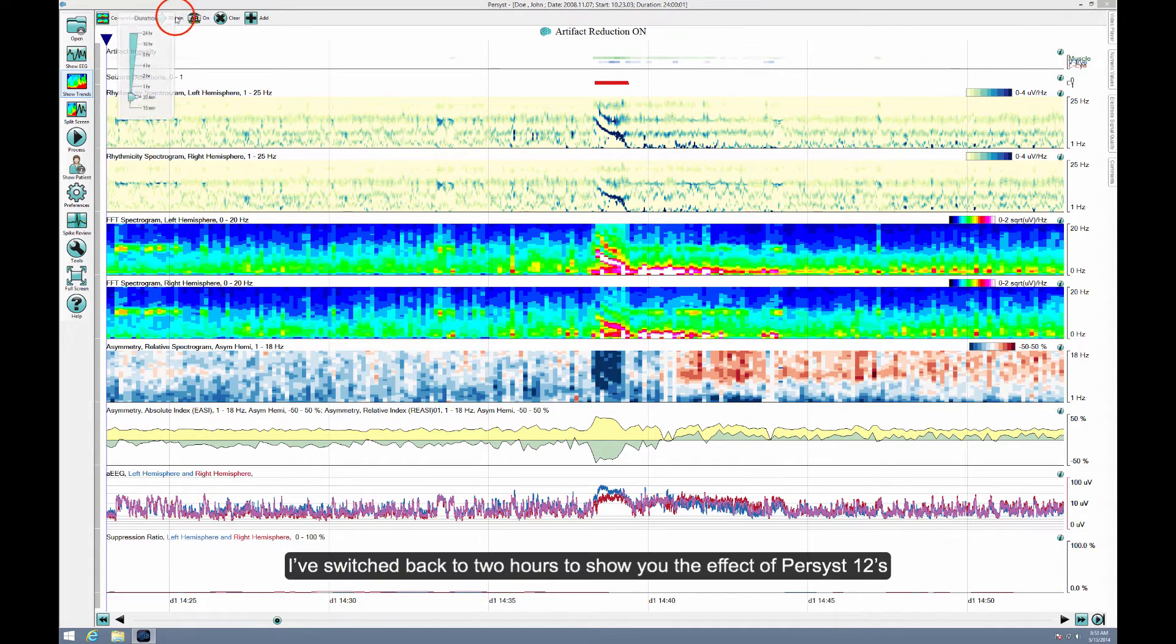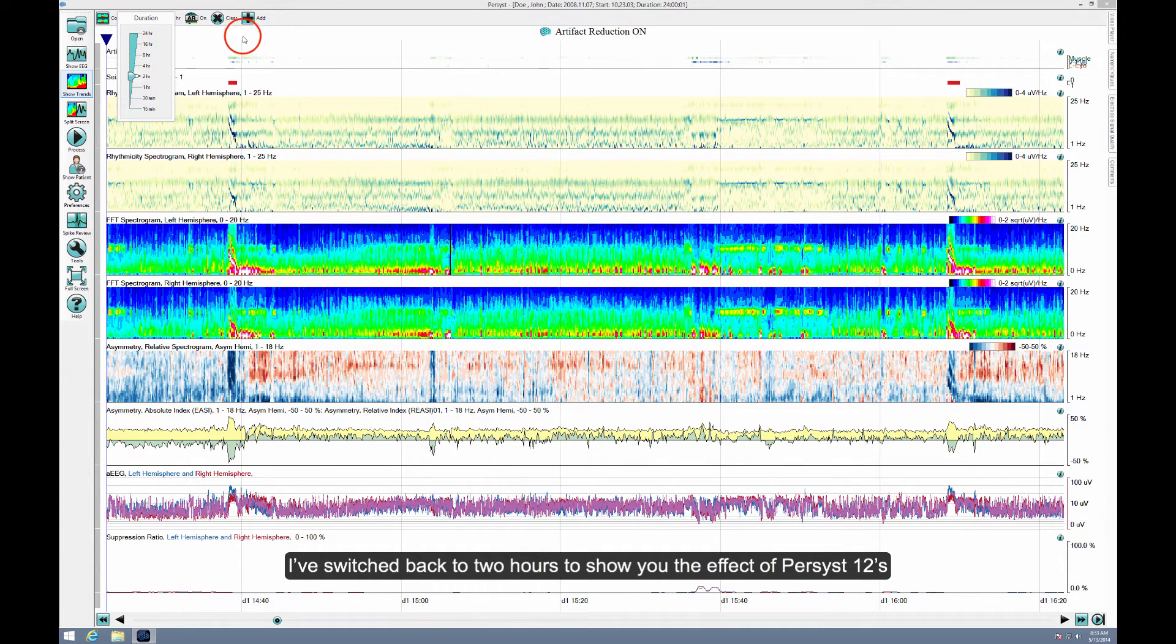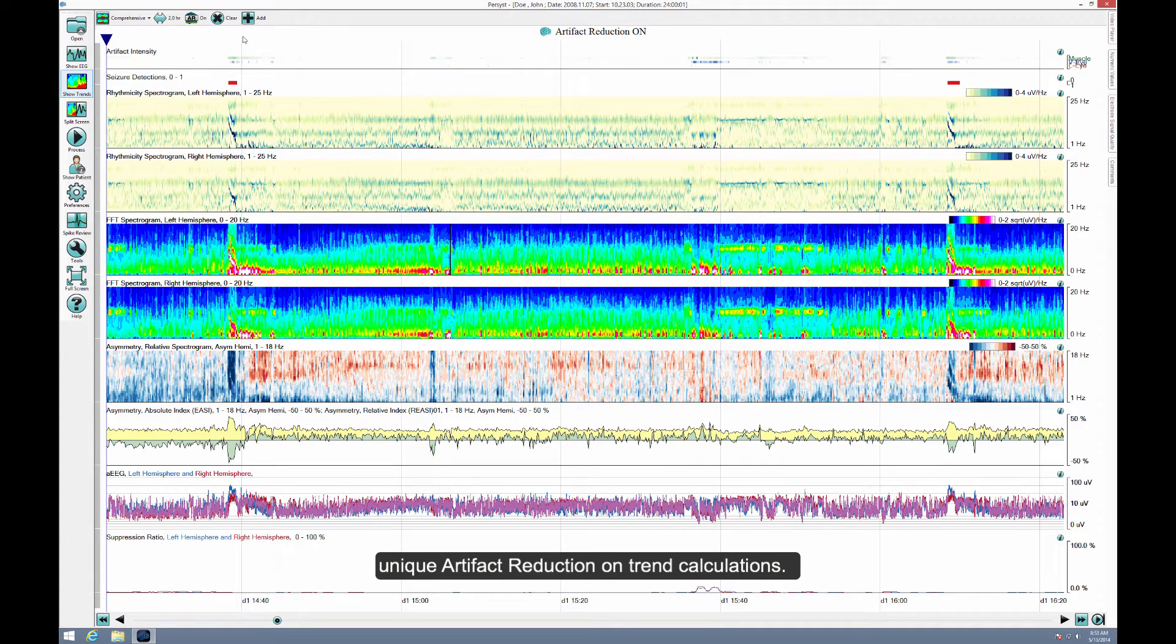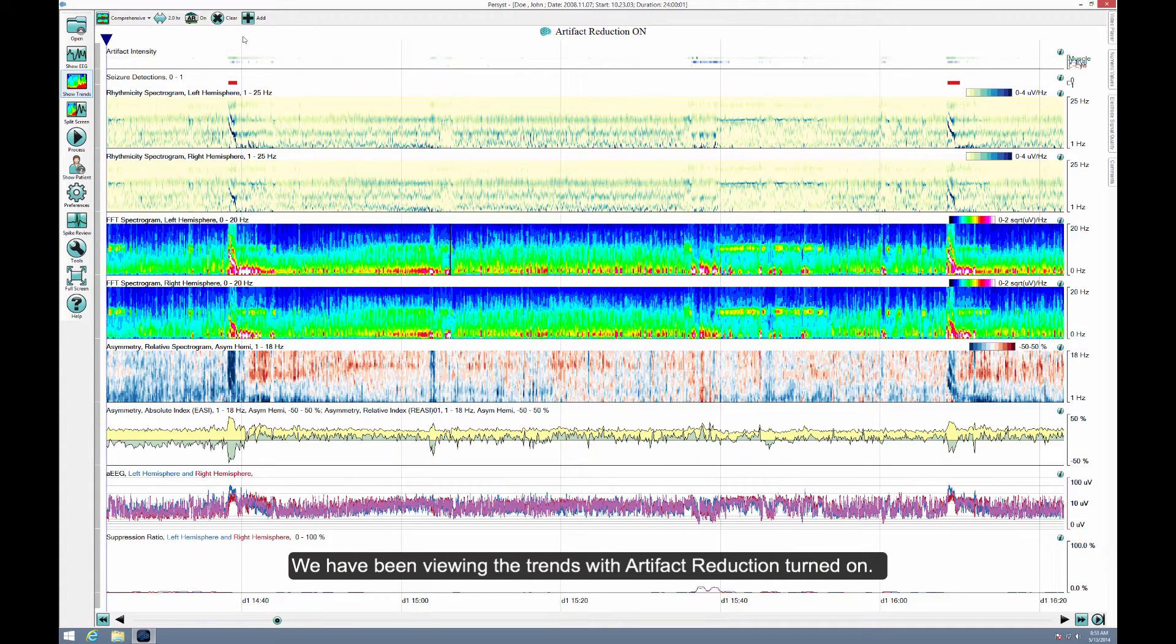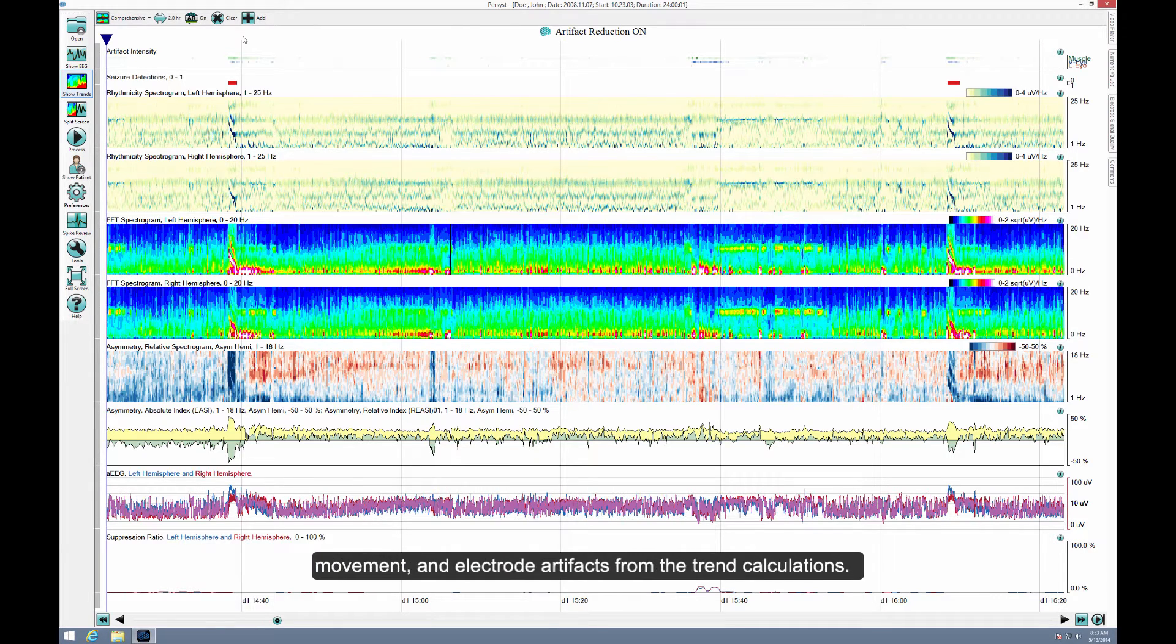I've switched back to two hours to show you the effect of Persyst-12's unique artifact reduction on trend calculations. We have been viewing the trends with artifact reduction turned on. This removes substantial amounts of the effect of muscle, eye movement, and electrode artifacts from the trend calculations.